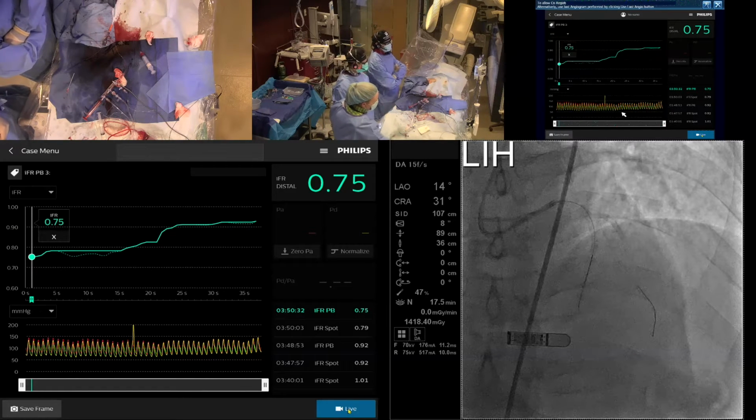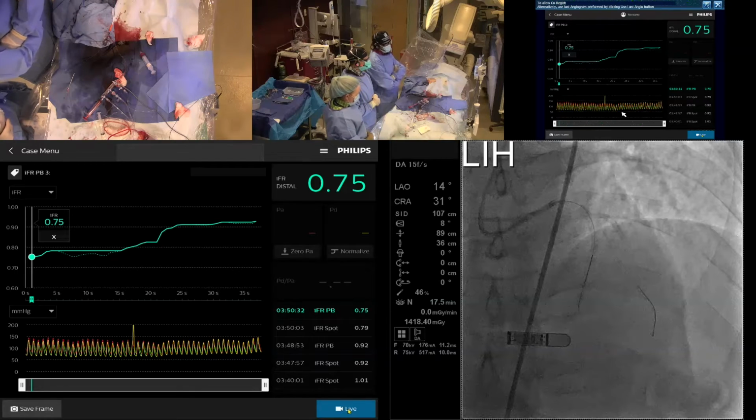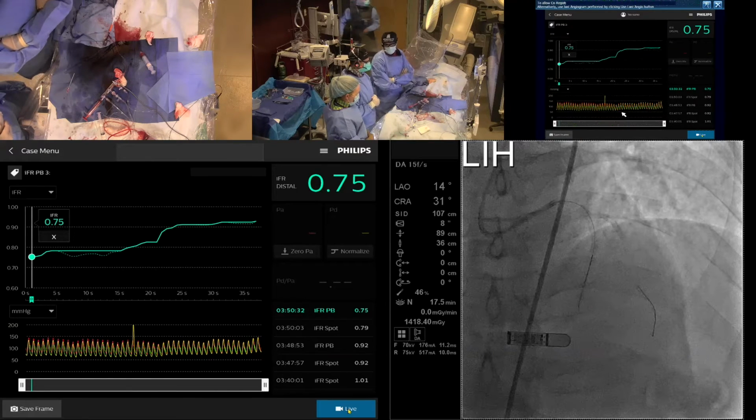There's no room to put this map anywhere. Okay. So maybe do you want to IVUS this too or no? I think the IVUS might be difficult to cross, and it might mangle the stent, which I don't want to do. So let's do this as a physiology guided PCI. Let's open this and then we'll put a 2.5 by 15, and then remeasure the iFR. Yeah, I agree.